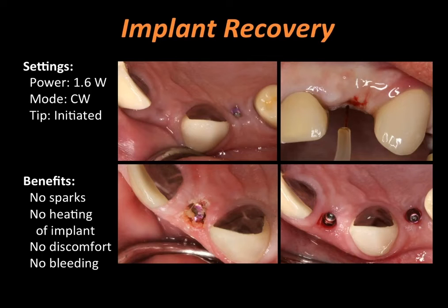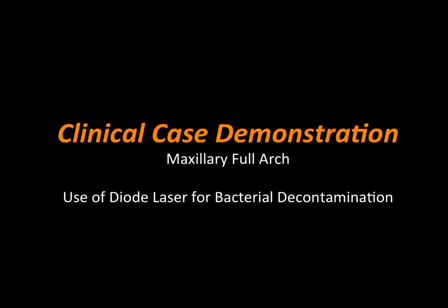Implant recovery. As I mentioned, we do a lot of dental implants, as many of you may know. We can use the dental laser in this site very effectively. We don't have to worry about sparking or heating of the implant, and we can oftentimes do this procedure without any type of anesthetic as long as you take your time, and very little bleeding. You can see we're using the laser to expose the cover screw or closure cap. We'll remove it, we'll take our impression, and we'll get very, very nice healing in that area. And this is imperative, especially in the aesthetic zone. Our final results are very, very important.